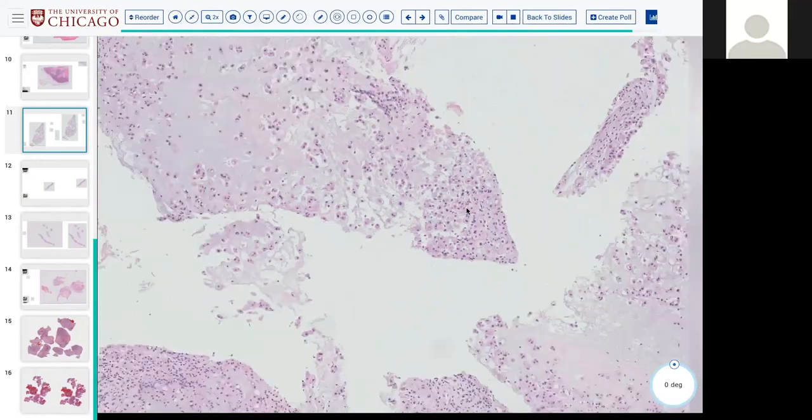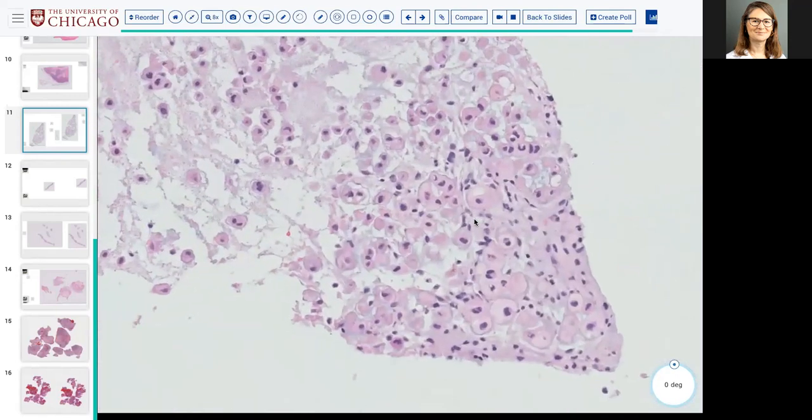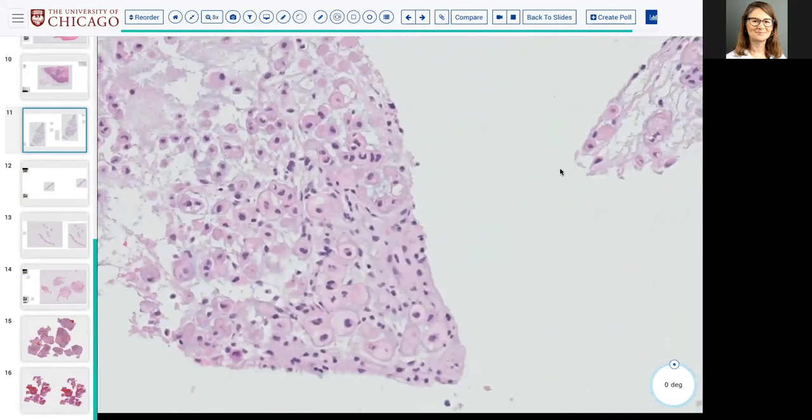They can become poorly differentiated and so-called de-differentiate, in which case they have a sharp transition to a high-grade undifferentiated spindle cell neoplasm. Just like chondrosarcomas can de-differentiate, chordomas can de-differentiate into a spindle cell type of process.